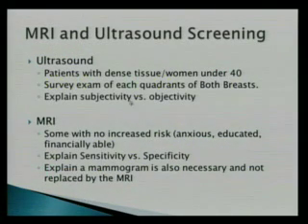Ultrasound screening is not really done. I mean, it's not required or anything, but for us, if the tissue is really dense or the woman's under 40, we generally start with an ultrasound, and you'll survey each breast. The problem with ultrasound is obviously that it's up to the tech or you, whoever's doing the exam. It's very operator dependent, and you can easily miss things. So, that's a problem. If you don't do breast ultrasound all the time, you can miss things. So it's not as objective as a mammogram or an MRI.